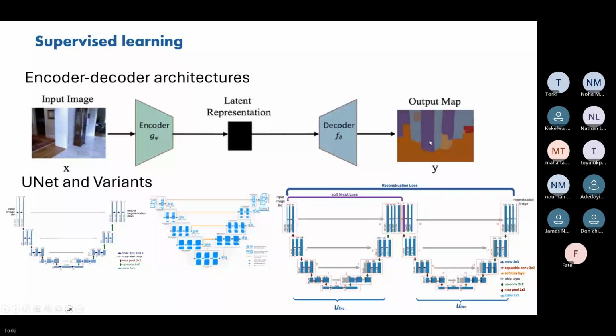So learning this encoder-decoder architecture is done via some neural network algorithm, backpropagation algorithm, whatever. You are feeding the algorithm with pairs, image and label. And we call the label for this image ground truth. And through the learning, the architecture here that is called the encoder-decoder will learn whenever they see this image how to produce this correct output. This is what is called encoder-decoder architecture.